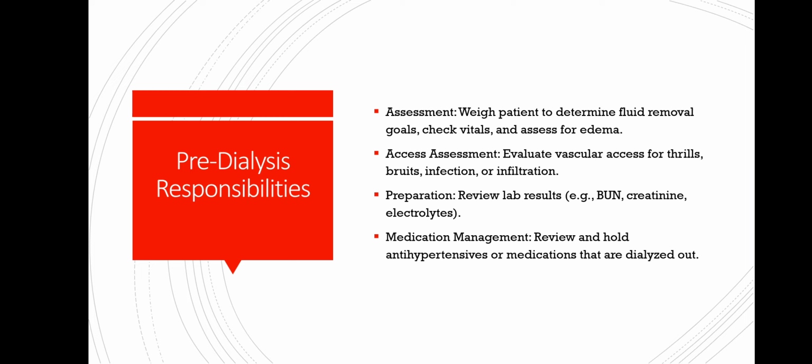Then pre-dialysis responsibilities. First one, pre-dialysis responsibilities are mainly assessment, site, then preparation and medication management. Assessment means weigh patient to determine the fluid removal goals and check vitals and assess for edema. Site assessment, it's to evaluate vascular access for thrill or bruit and infections or infiltrations.